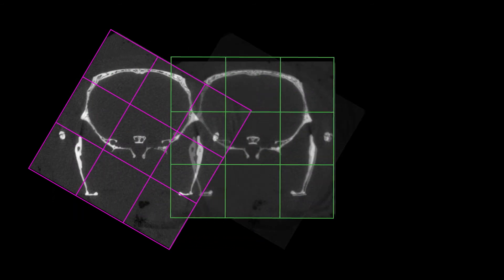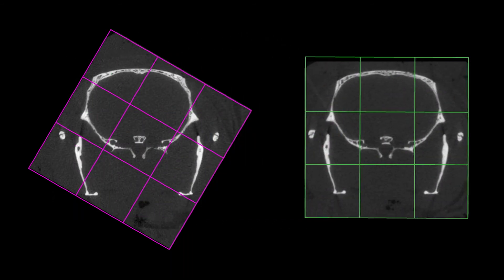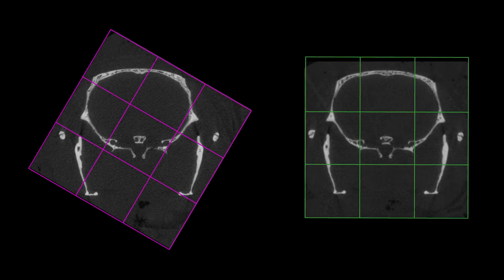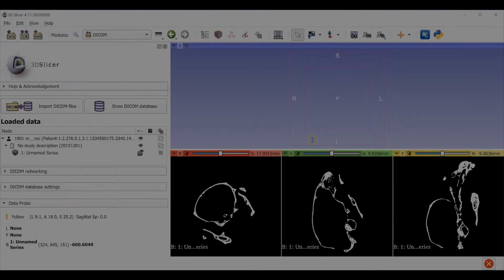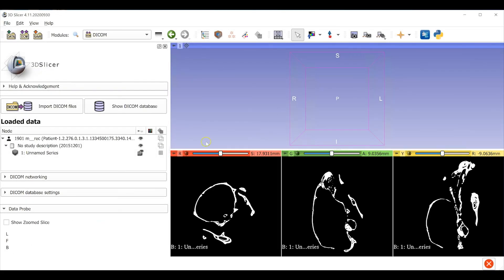I call this second method an external transformation because the voxel structure gets transformed and exists outside of 3D Slicer. The second workflow uses a similar approach to transforming the volume, but also has an added step of reslicing the transformed data and changing the voxel structure so that the cubic voxels are aligned with the orthogonal planes of the skull. So first we'll set up the workspace. And let's start back at the default layout in 3D Slicer where I've loaded the same Dicom volume.